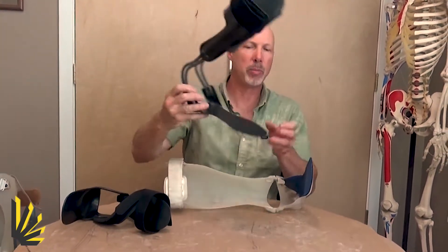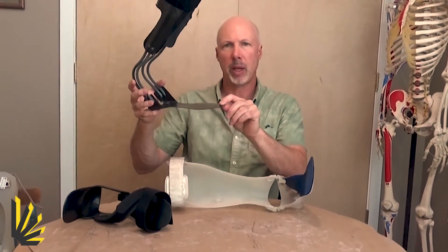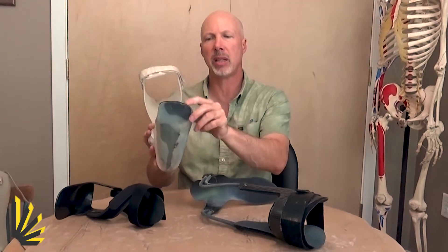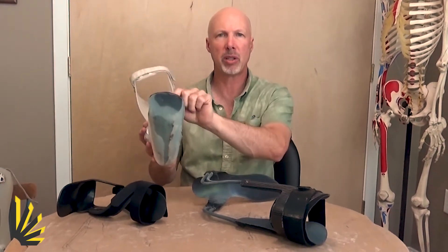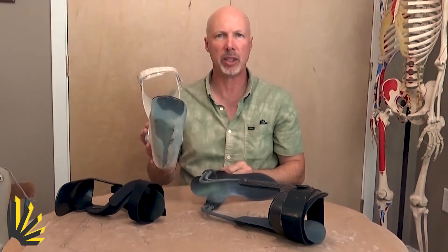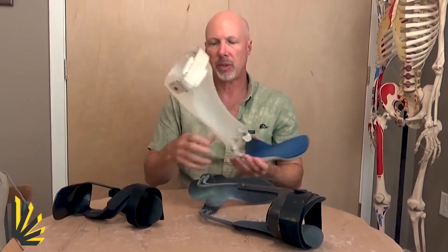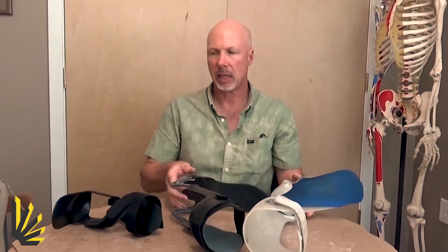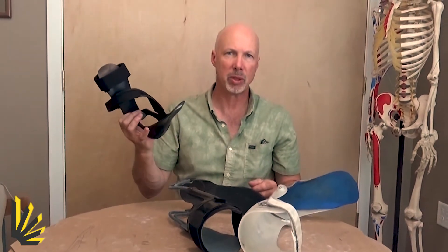Some of these braces have footplates that are very long — a toe plate — and maybe even this one here is a sulcus trim line, meaning that it includes the metatarsal heads but the toes kind of hang over the edge right there. So here we have three different versions of footplate design, yet this one turns out to be the most effective.